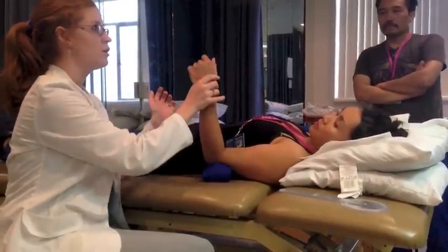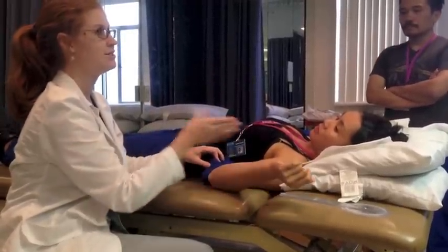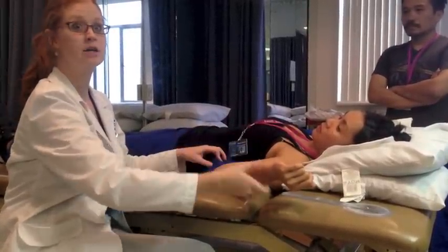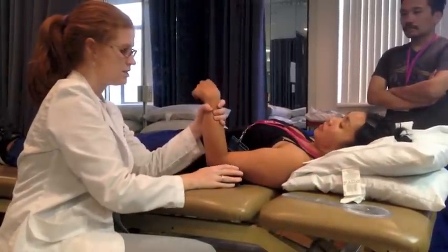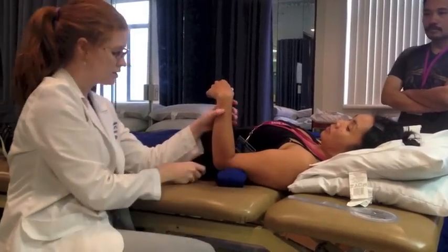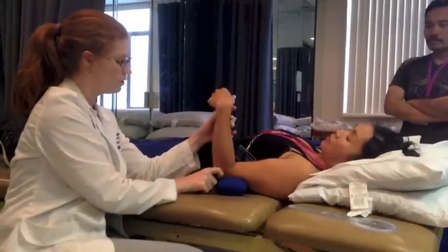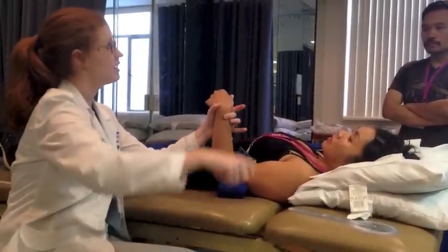Now I'm going to take her into lateral rotation, but what wants to happen to the humerus? It wants to abduct. So our stabilization is easy because the table is essentially stabilizing the humerus, but we don't want the humerus to abduct. So you're just going to hold on to the elbow a little bit to prevent it from abducting.